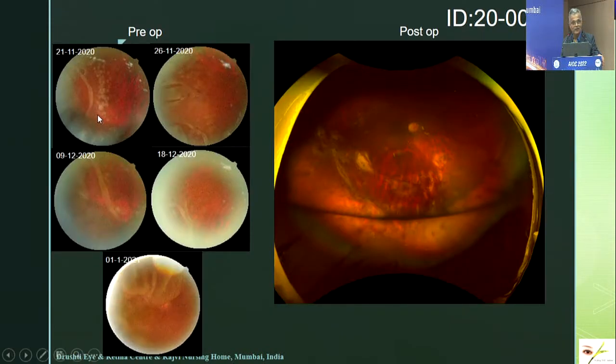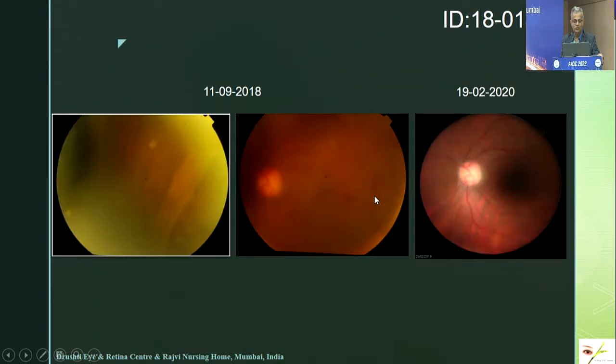Now another patient had a large tear, more like a giant tear but a little less than a typical giant tear because it was not 90 degrees. It was lasered well, but after 1.5 months he developed detachment with PVR and needed vitreous surgery, and we did silicone oil and buckle. He still had a recurrent shallow detachment and is being conserved because the macula is attached. So you need to follow up this patient.